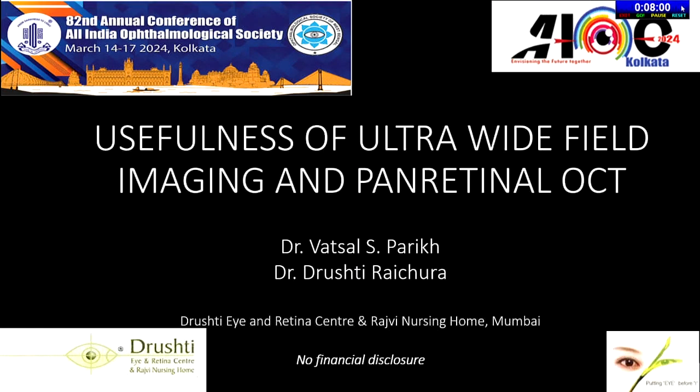First of all, I think Dr. Rajiv gave a great talk, a really great overview of what we've learned about the importance of these peripheral findings. They have prognostic value in various diseases. I think Dr. Rajiv spoke beautifully about how in diabetic retinopathy, these peripheral lesions, these areas of peripheral non-perfusion, make a big difference. The fact that for so many decades we've been staging the disease using mainly the posterior pole or the 7 standard fields really highlights what we've been missing. So I think it was an excellent presentation.